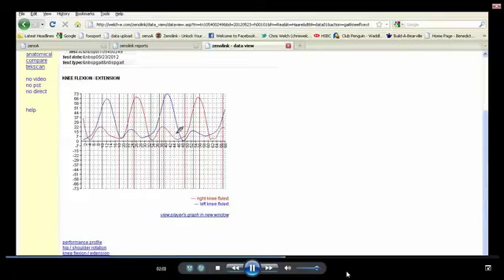The right knee, for the most part, seems to be extending all the way through toe off, whereas the left knee is going into a little bit of flexion. So we have a better overall range of motion, better overall patterning on the left side than the right side.